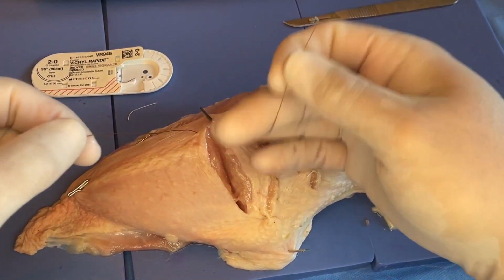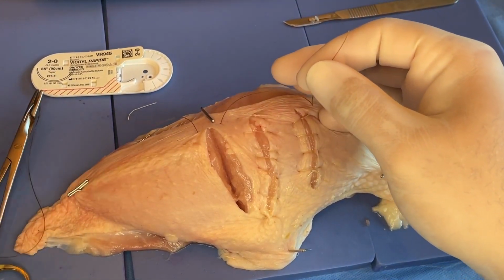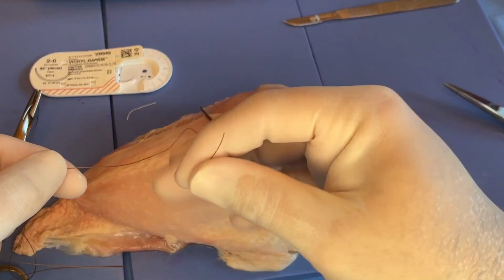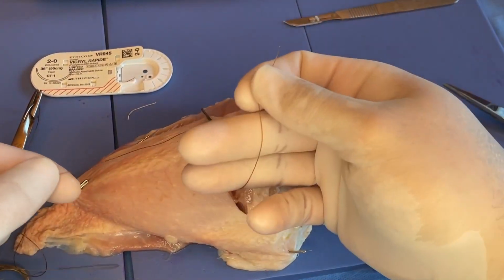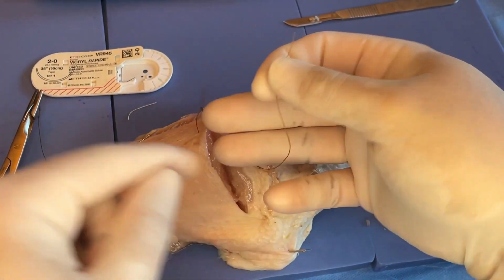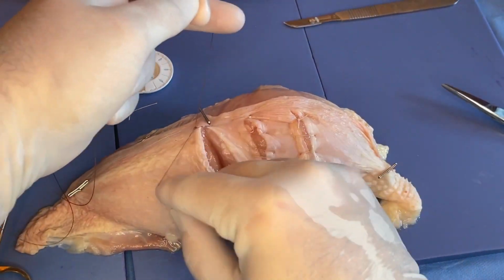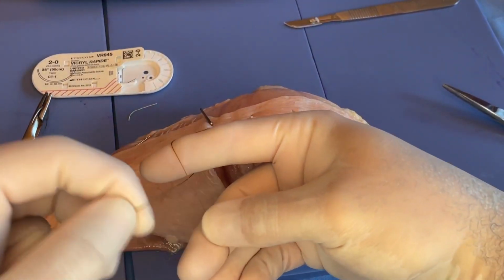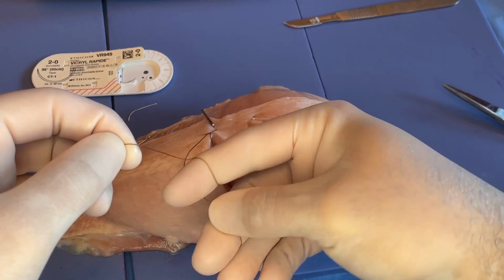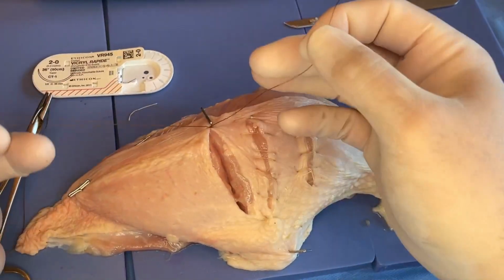Oh no, what the heck, let's do it one-handed. So for me, one-handed, again, I have the needle attached over here to my left. So I start off with the free end here, and I wrap around two fingers, so I'm making my loop there, and then trapping the free end and pulling it through, and then I do that little crossover, and then make the little loop around index finger, do that little pull through, so I trap it, pull it through that side, and then down.